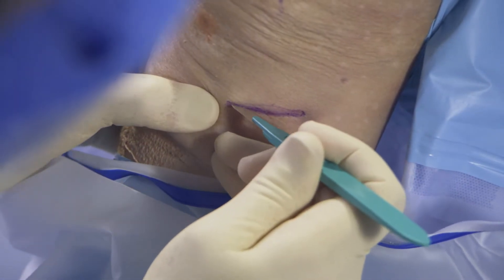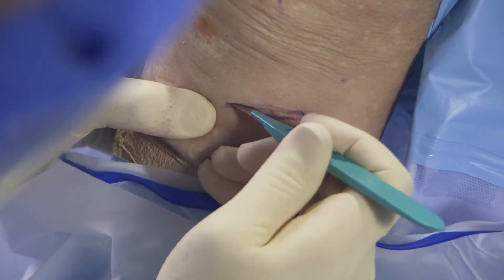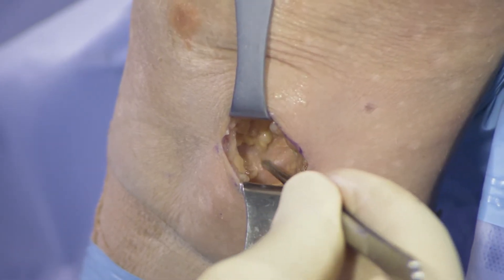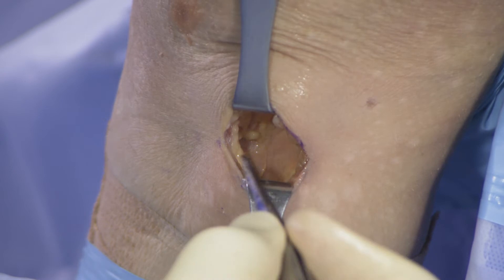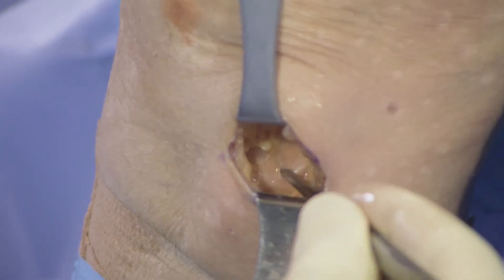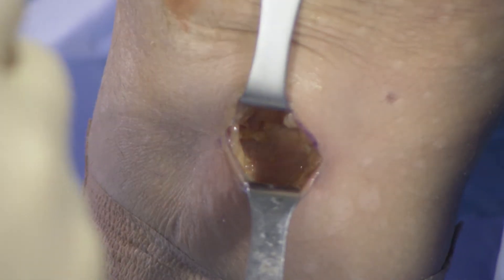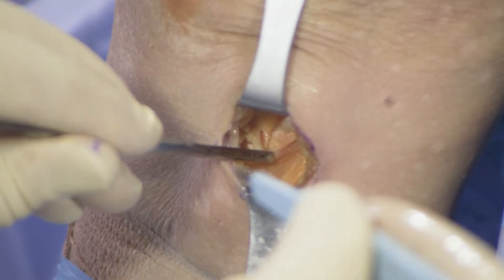Sometimes it's very easy to palpate the tendon and feel it under your fingers. When making this incision, it's important to go directly down to layer one and clean layer one off very carefully before any further dissection is performed. Here you can see the tendon moving beneath the forceps. It's very important to localize the top portion, just above the gracilis. Once that's cleaned off and visible, we typically grab layer one with forceps and take a 15 blade and make a small window in layer one, again just above the gracilis tendon.